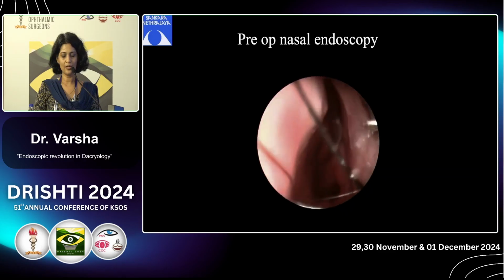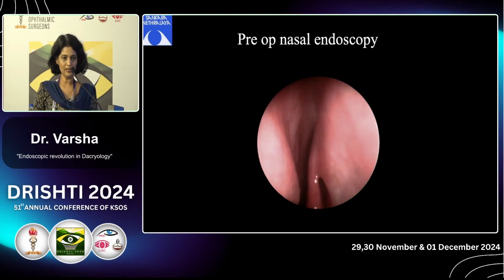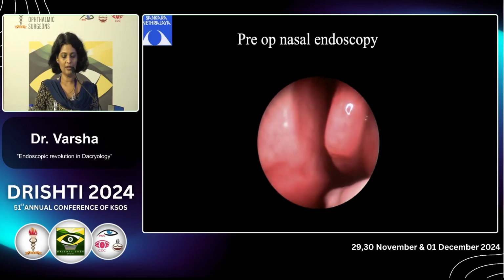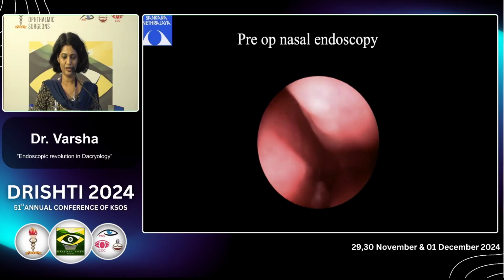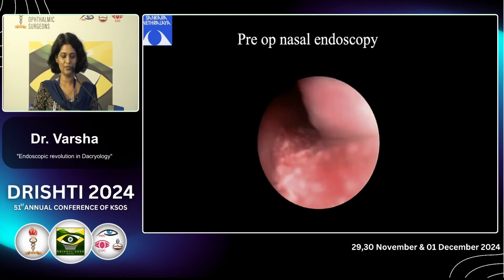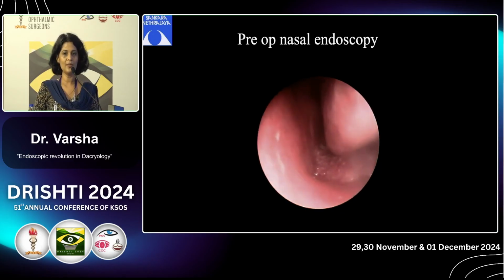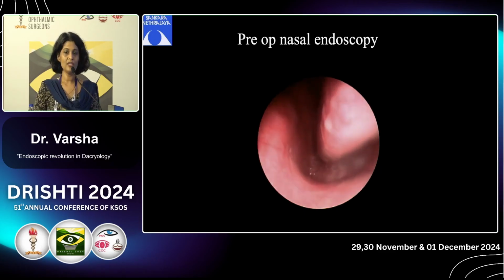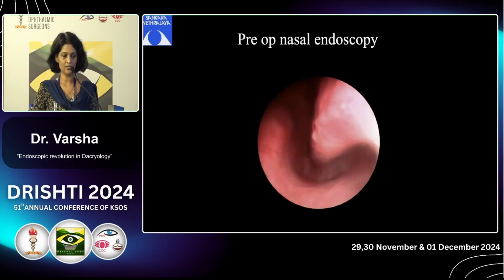So this is a patient wherein you can see the middle turbinate very clearly. It looks nearly normal. But as you pass the probe into the middle meatus, this also looks pretty okay. Now you can see a fleshy growth, a grayish mass with white spots on it, in the inferior meatus as well. So this is basically a rhinosporidiasis, a similar case as presented by Dr. Ann. So it is very crucial to do a nasal endoscopy for all primary acquired nasolacrimal duct obstruction patients.